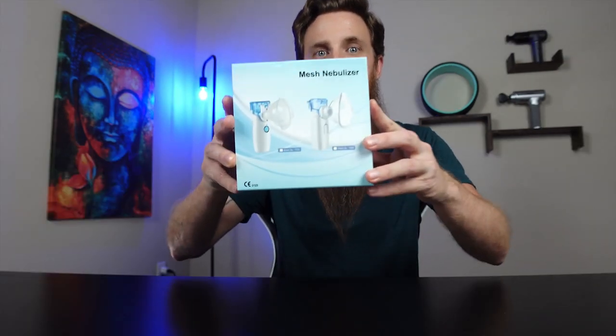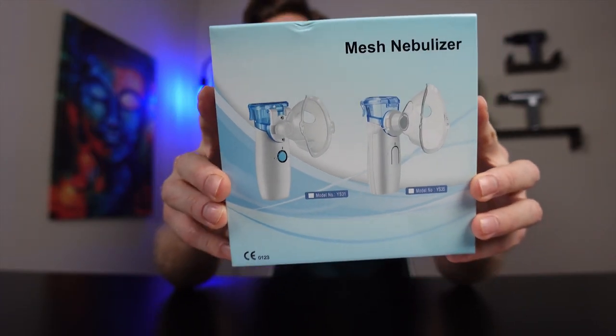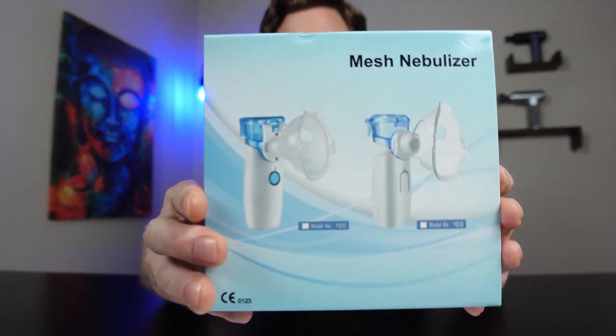Hey guys, Matt here with 'To Buy or Not to Buy.' This is a portable nebulizer which was sent to me. I do have asthma, so you can use this for a lot of different things — asthma, cold, cough, any type of sore throat, rhinitis, things of that nature.